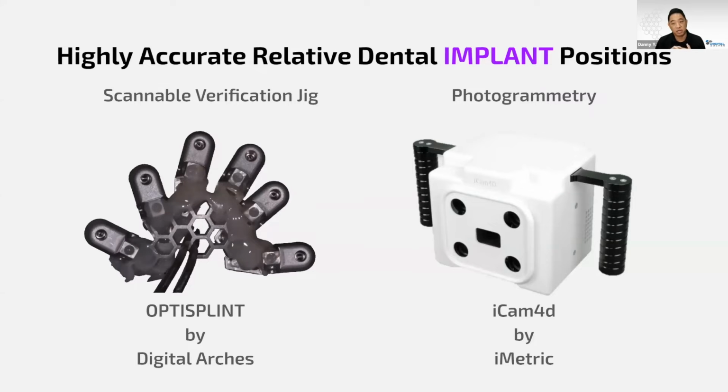The second human factor is how well trained the person that's scanning the device is. If you go to the Mod Institute, they have a whole day of live training that you can take in terms of how to capture scans much more accurately. Understanding how to do those scans very accurately is a unique skill that not everybody has. So that second person scanning is also a human factor.